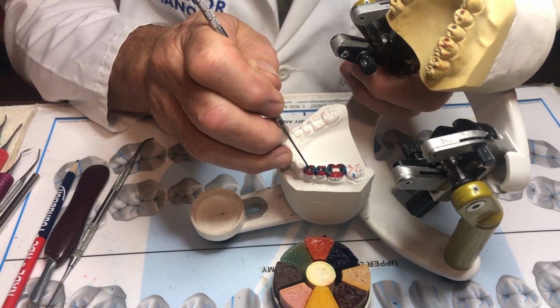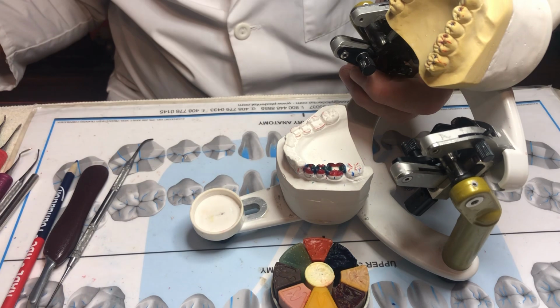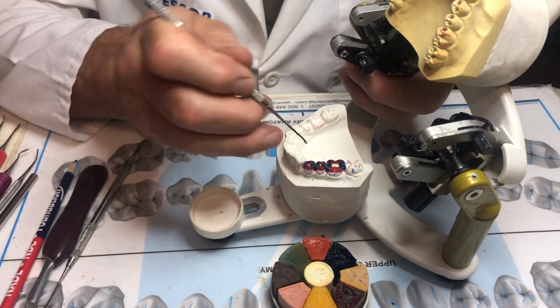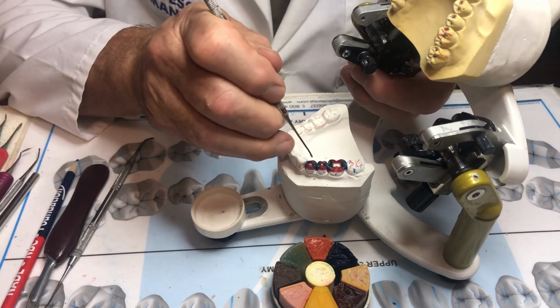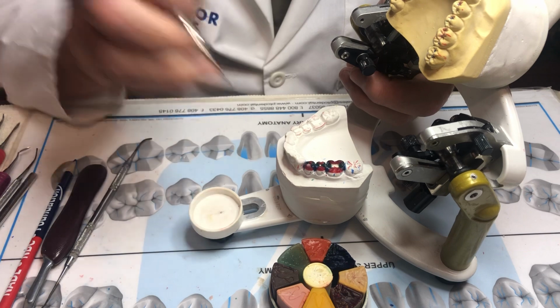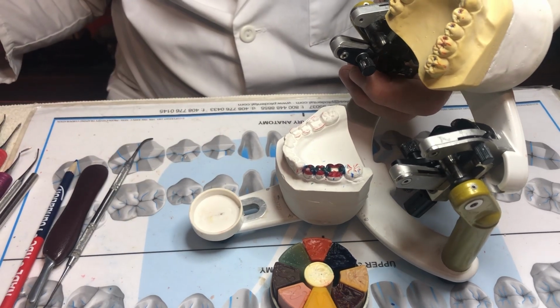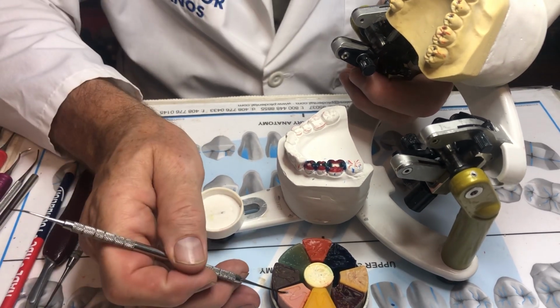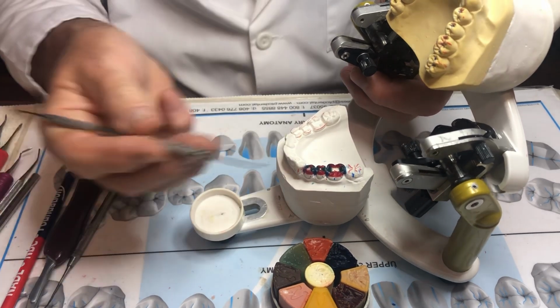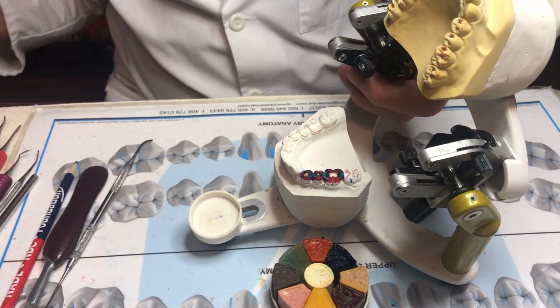So I'm building, and also besides being shaped like a triangle, it is not concave, it's convex. Therefore, the ridge is sticking up into the occlusal surface. If you accidentally make it concave like a slide, you'll get the shape, but you'll never get the contact. So again, we're doing everything with the PKT instrument.